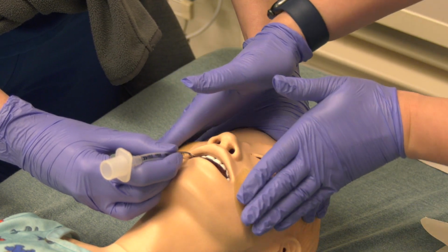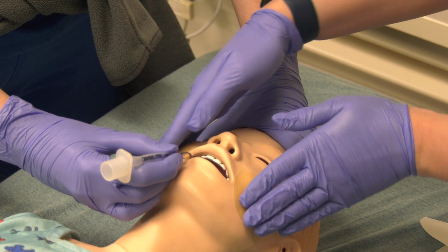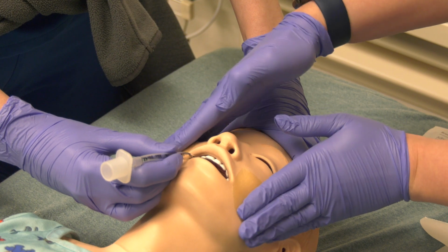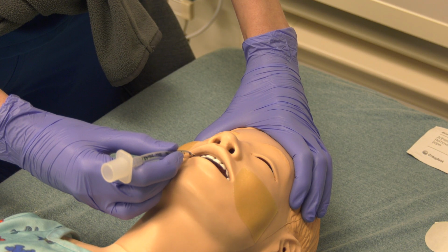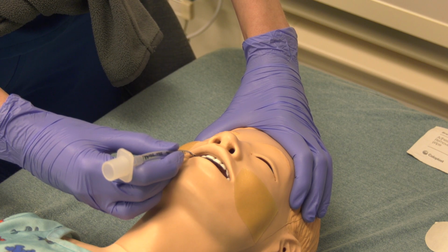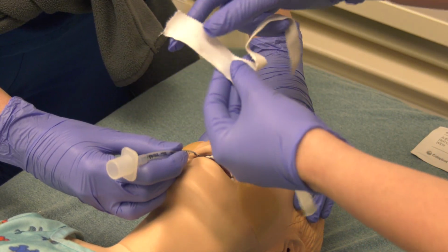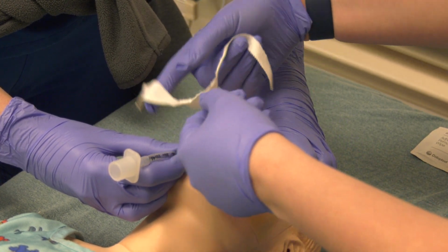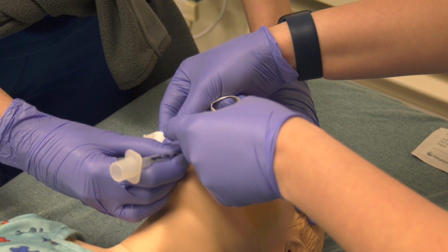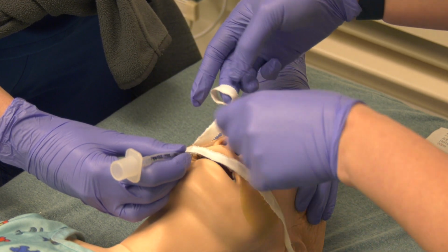Just to ensure that the Duoderm is completely adhered to the face, you can use the warmth of your hands. And I'll begin to put the first piece down. You want to make sure that the first piece has a good amount of coverage on the cheeks. The longer and bigger the coverage, the better securement.